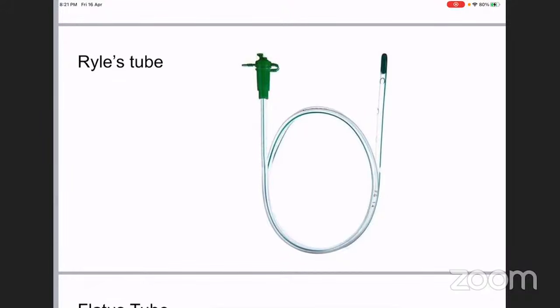And that is why whenever you want gastric aspiration or you want gastric feeds through the Ryle's tube, you place the Ryle's tube such that the nostril is at a point between the second and the third mark. Okay, that is when the tip of the Ryle's tube is within the gastric cavity. And the fourth mark corresponds to 65 centimeters from the tip, and if it is appearing at the nostril, it means that the Ryle's tube has passed all the way up to the duodenum.